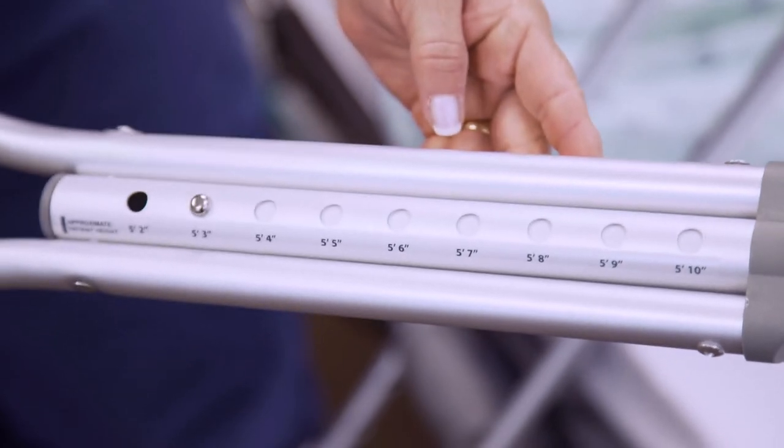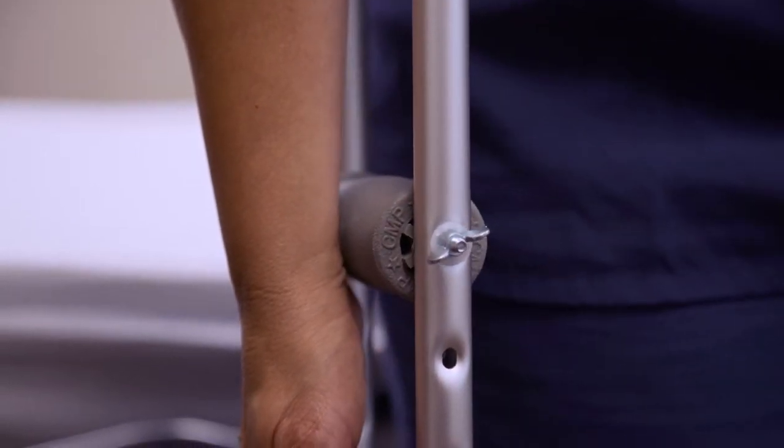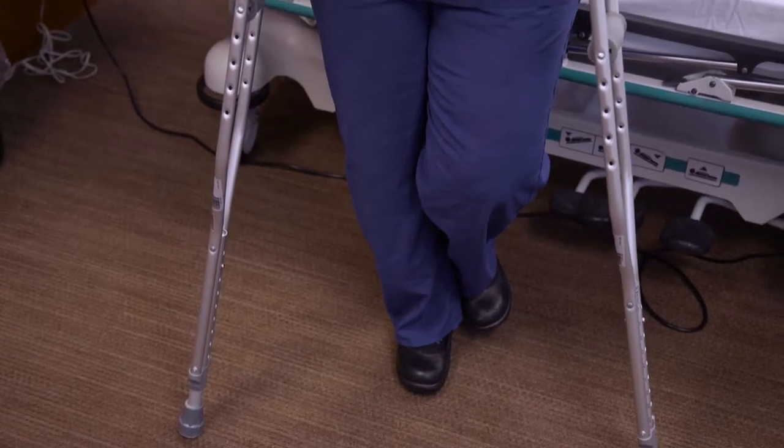Adjust the conveniently marked base of the crutch for your height. With your arms straight down, the grip should come to your wrists. If it doesn't, detach the wing nut from the bolt holding the grip and adjust.